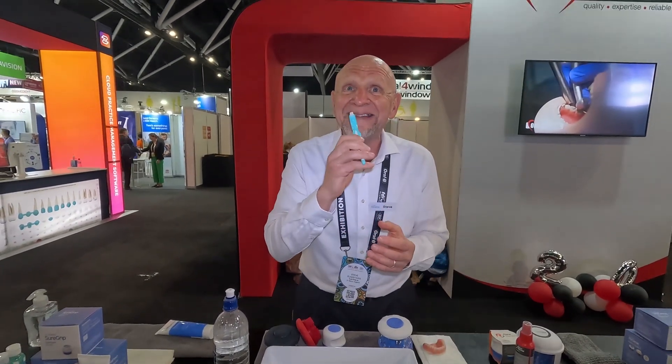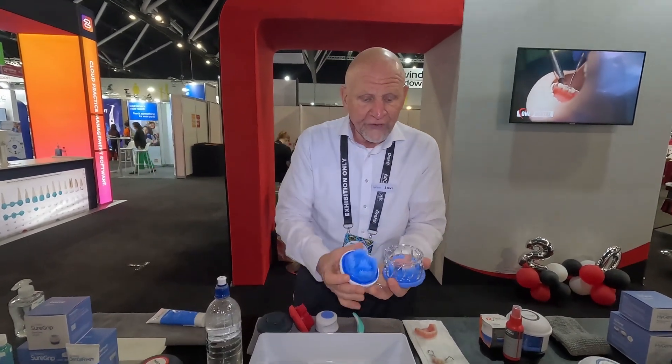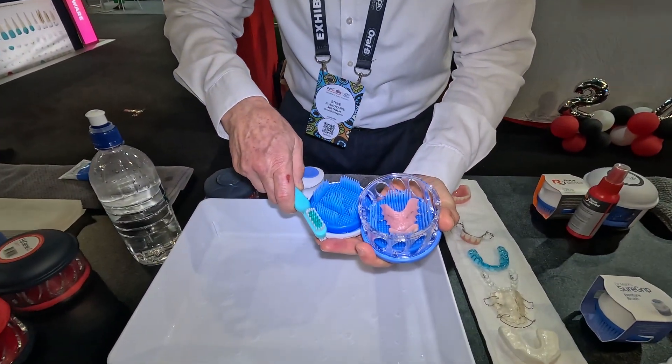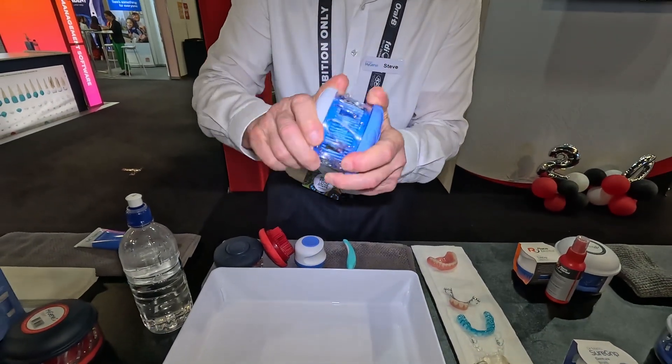A toothbrush is designed to clean teeth in the mouth — it's not designed to clean dental appliances in the hand. The HyGenie takes the hand-holding risk out of the equation. It also facilitates multiple surface scrubbing simultaneously with 10 brush heads in that enclosed environment.